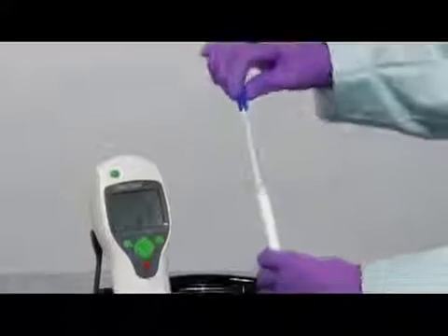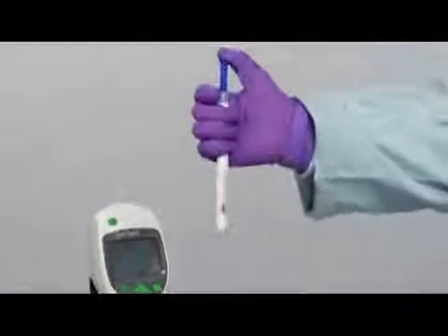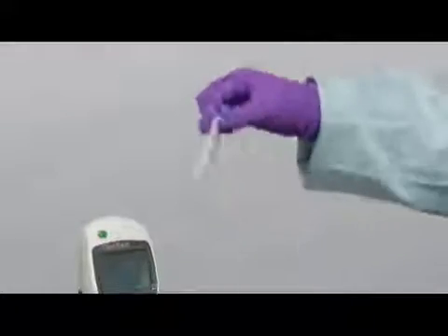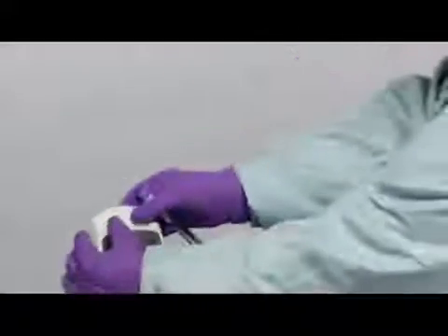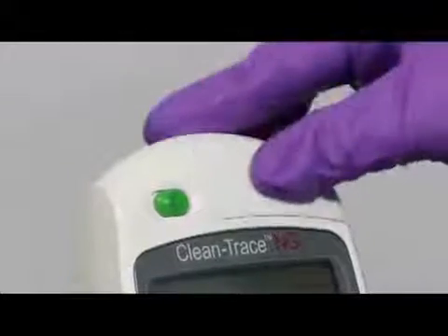Once you're through swabbing, then you measure just like you measure for your environmental surfaces or your surgical instrument application. You just activate, shake horizontally for 5 to 10 seconds, and then insert to the luminometer and get your reading. And that will complete your testing of the exterior surface of the distal end.